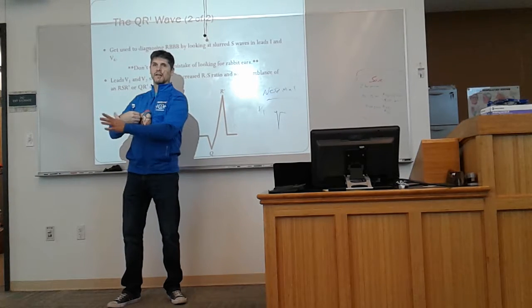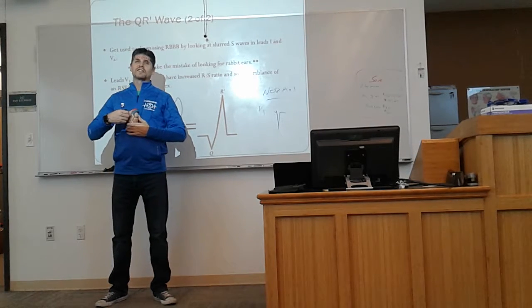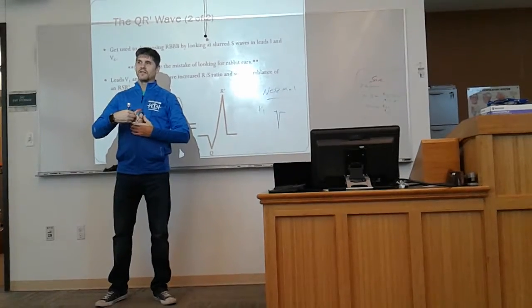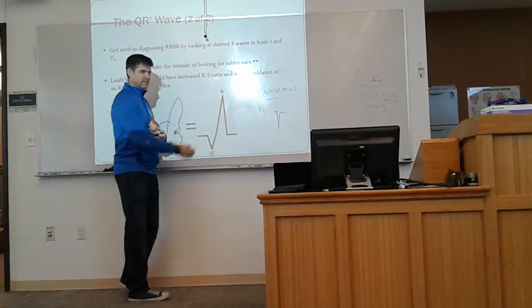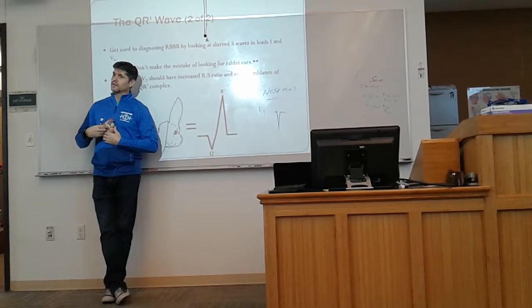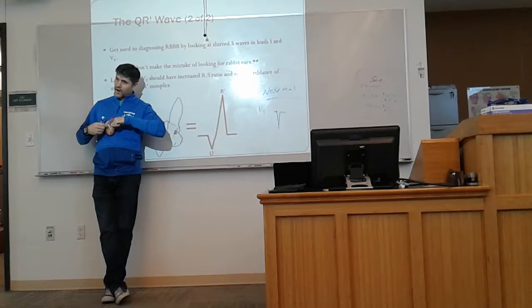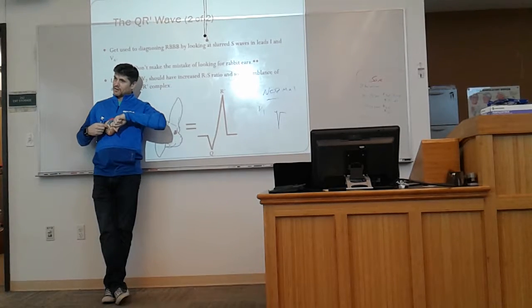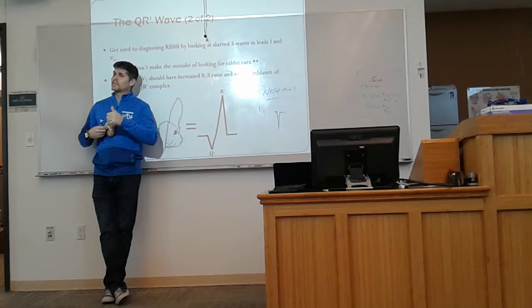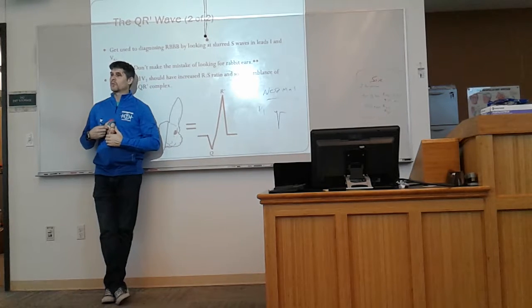Does that make sense? If the left side is the first thing that's firing, typically, what direction does the left side fire compared to V1? Away. So how would you get the R wave? It just depends on where anatomically the axis is of that heart. Sometimes the firing is more lateral and anterior in some people than posterior, and so V1 in that case would see a positive R wave. But what would its size be? Pretty small compared to what it's going to see on the right side.